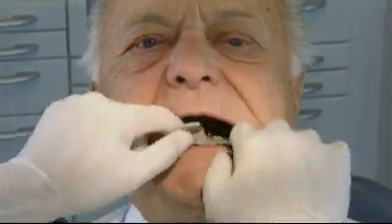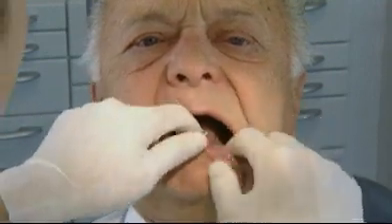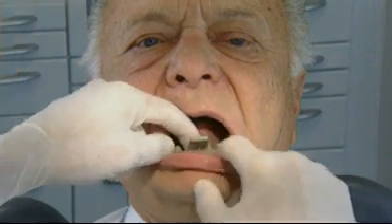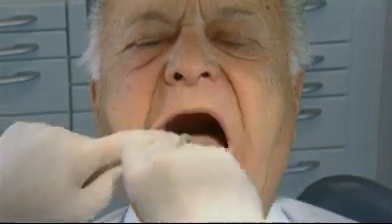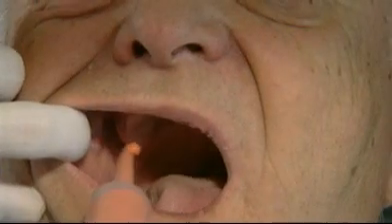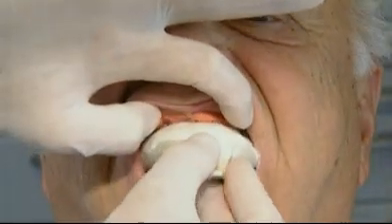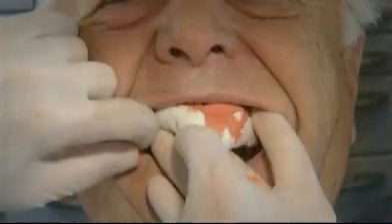Initial impression. After examining the anatomical oral conditions, position the empty mandibular tray on the mandible and check if the tray smoothly runs along the alveolar ridge without causing any pressure spots. Then insert the maxillary tray and again check the fit of the tray. It is advisable to use a hand-mixed alginate to take the first impressions.